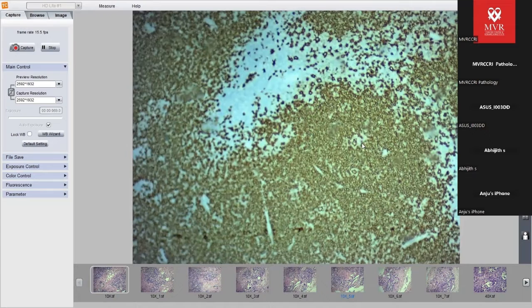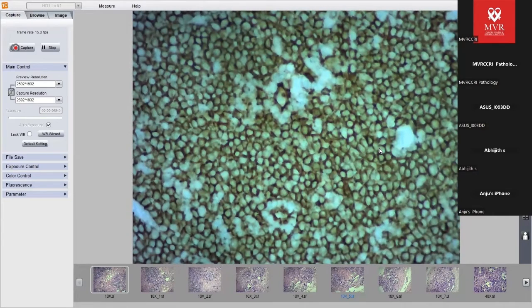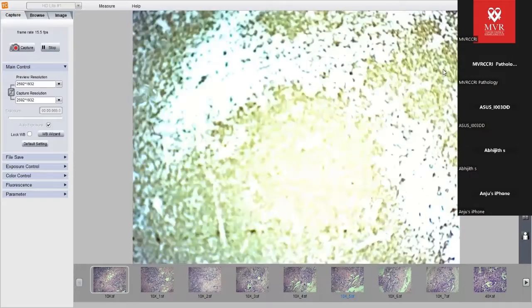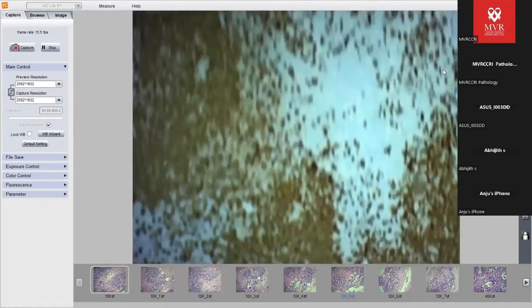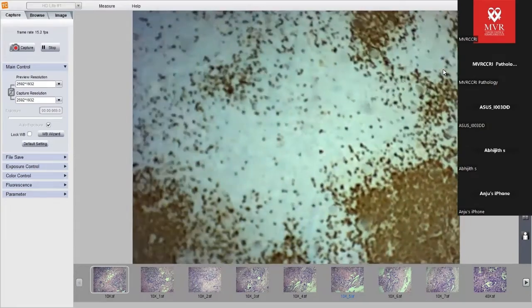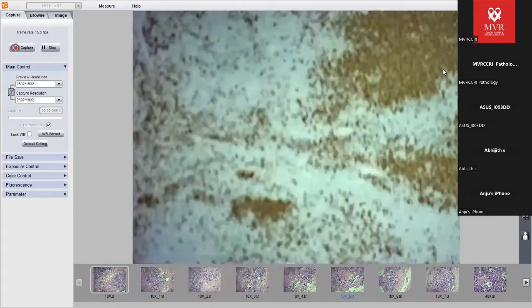There is a negative cell surrounding the CD20 positive cells, right? Rosetting. And these large cells are positive. Again, Golgi-like stain, very nice positivity. The background is a B lymphoid follicle. So favoring more towards the NLPHL. I'll show you a case of NLPHL later on. And we are having some large cells scattered outside the nodules also. I'll show you.